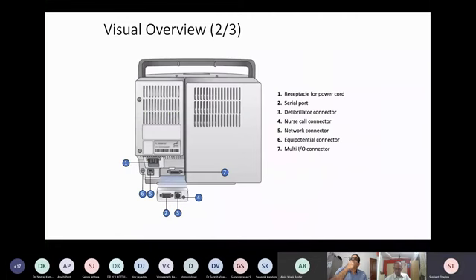This is an important slide only because what I wanted to show you here were the ports. Nowadays, sometimes it's important to identify whether the monitors are digitally enabled or not. In that case, you just have to ask or look for network ports within the monitor. And once the network ports are available, there are a lot of options to get the data out and put the patient monitor on a network. Why is this important? Because the communication becomes easy and your path to digitalization is that much easier. I'll not go into details of what other parameters are there, but the important thing to remember is that there should be network ports so that you can always hook up your monitor to a network.